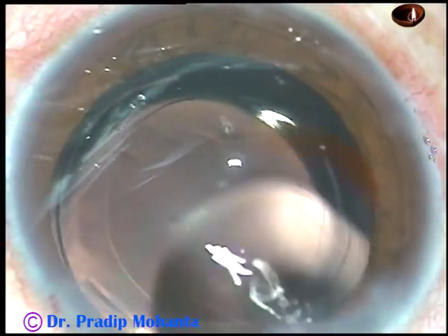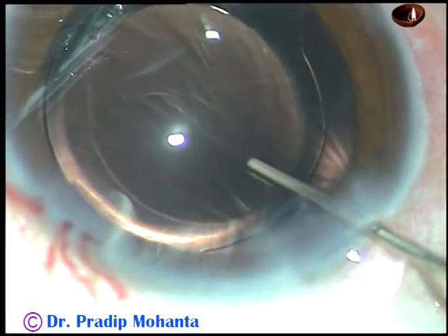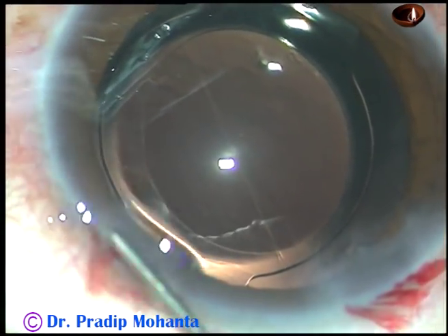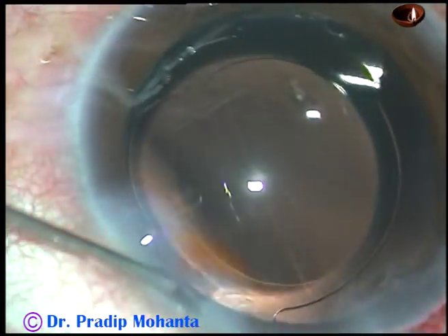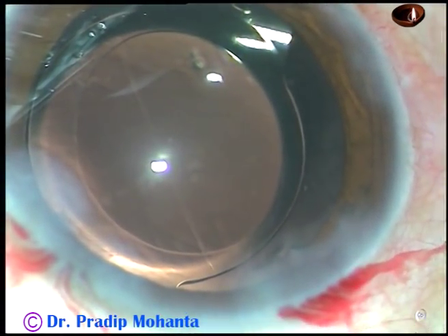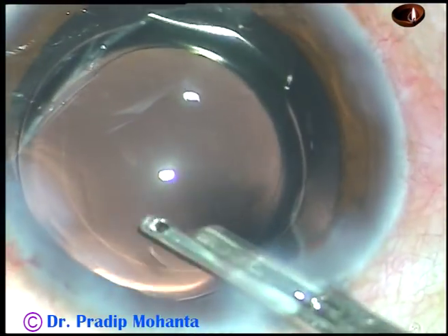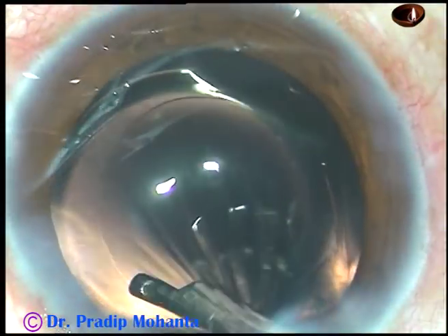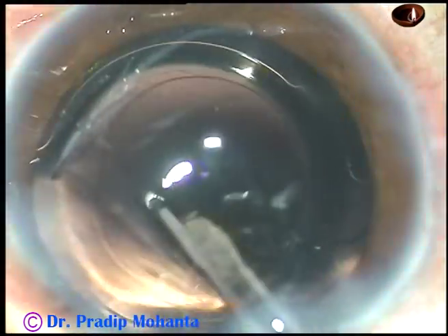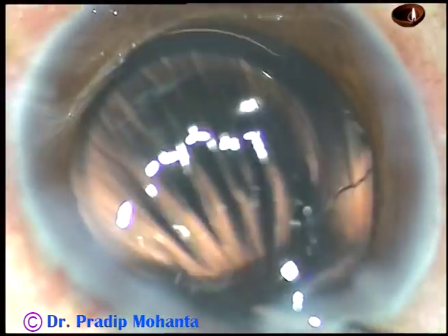Some more irrigation of the anterior chamber is done because there is some viscoelastic in the anterior chamber and that should come out. This is a bit of moxifloxacin. Now the side ports are hydrated to make these wounds watertight. A final lavage of the anterior chamber is done — this is very important. The anterior chamber should be nicely lavaged at the end, with no particles, nothing in the anterior chamber, and it should look clean.